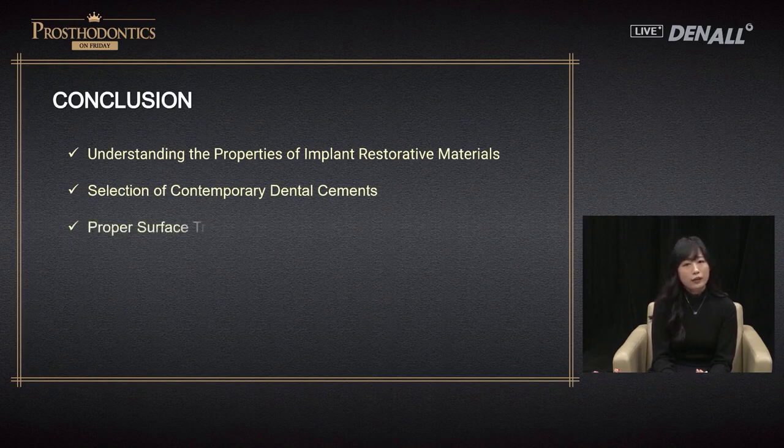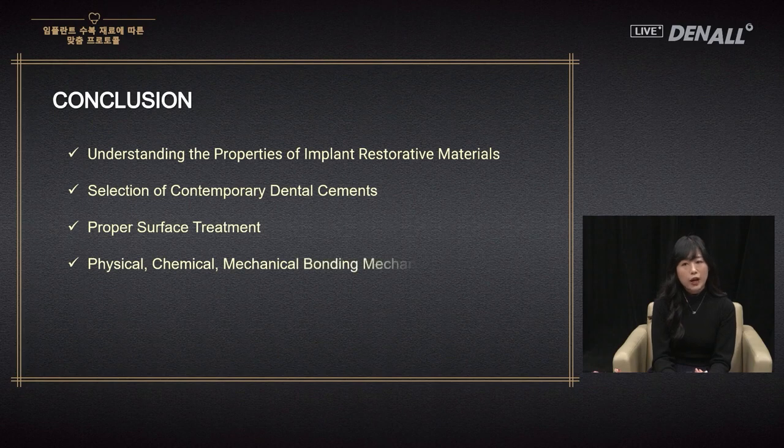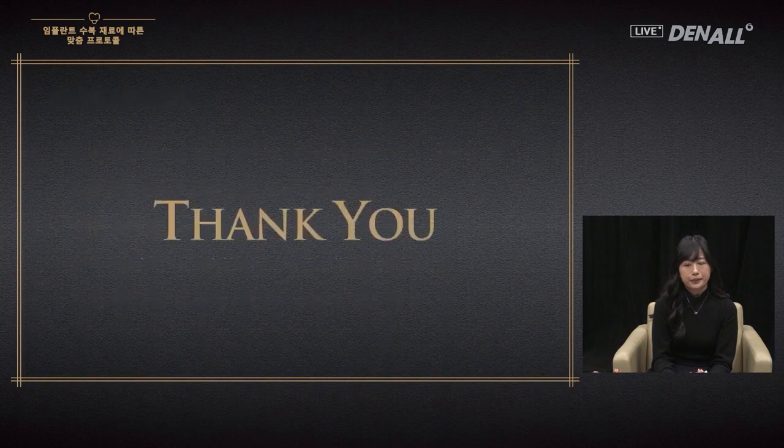In order to achieve this, you need to continue to update the information on implant restorative material and cement material, and you need to conduct appropriate surface treatment for the abutment and inner surface treatment for the restoration to provide successful and durable restorative treatment.